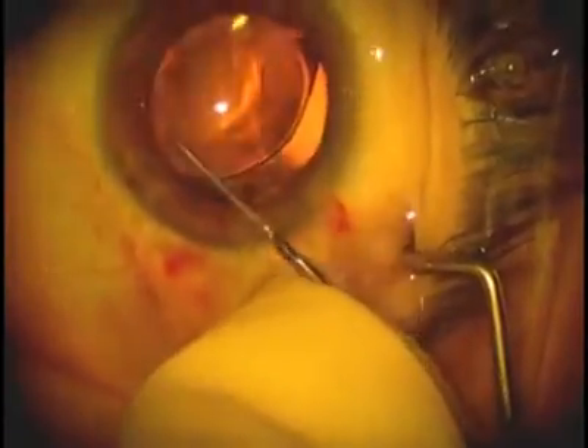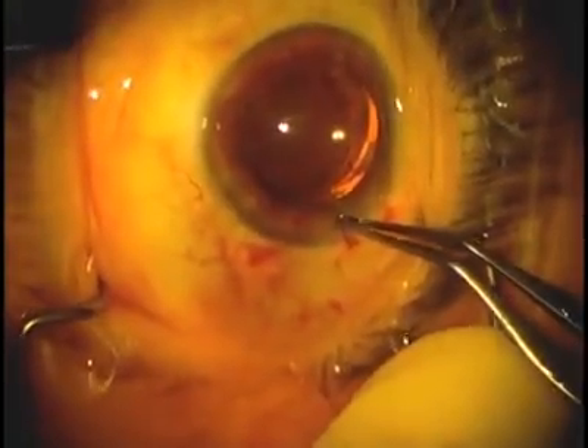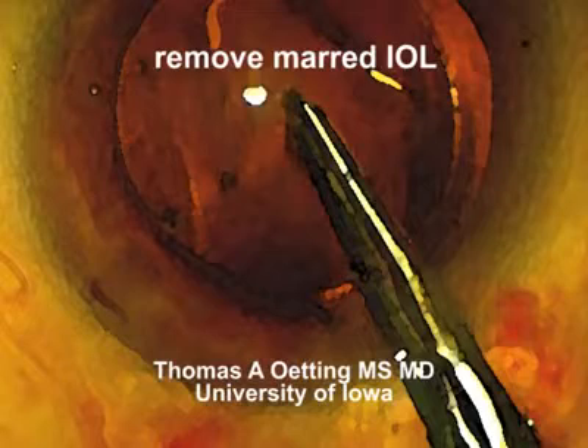I usually place a suture when something like this happens because sometimes the wound is a little bit bigger than usual, and so it's a good idea to go ahead and make sure that it's sealed by placing that suture. This is Tom Oding, University of Iowa. Thank you very much.